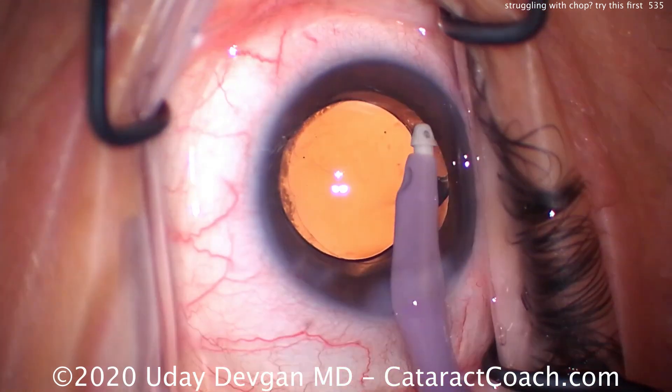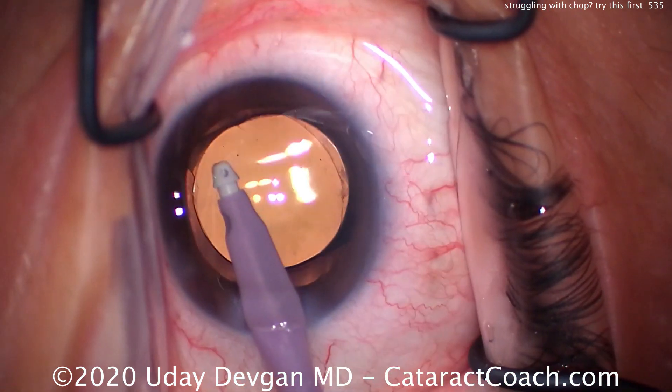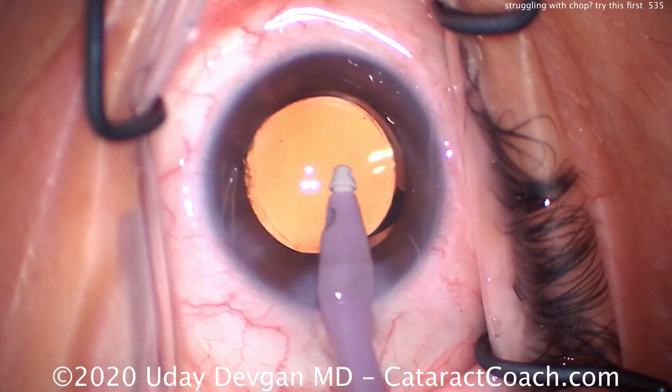Here's the IOL — looks good. Let's clean up the undersurface of the anterior capsular rim, do a little capsular polishing here, get that pretty clean. That looks great.